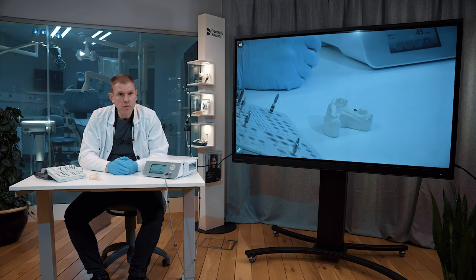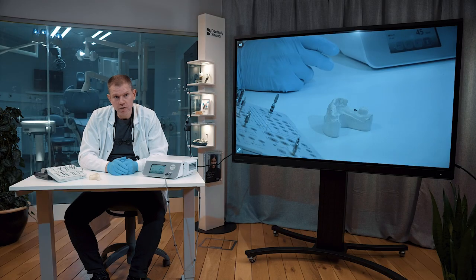That was the easy and very straightforward handling procedure for the DS Prime Taper Guided Surgery concept. Thank you very much for watching.